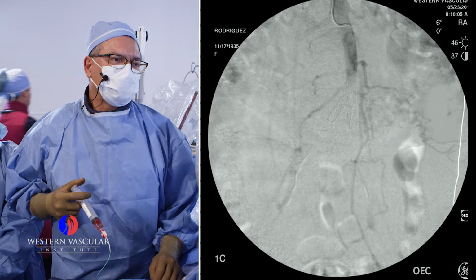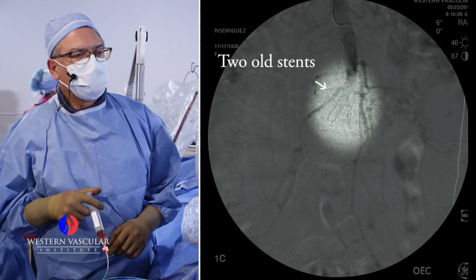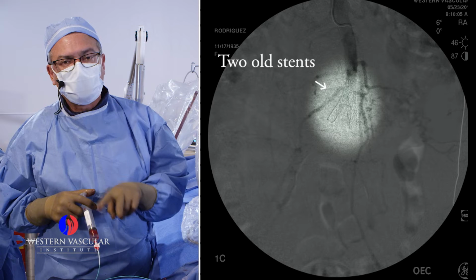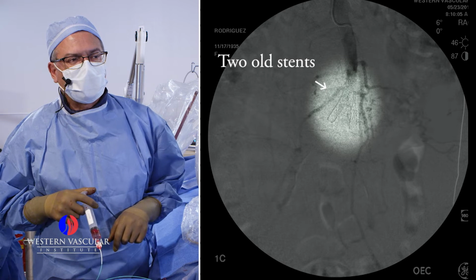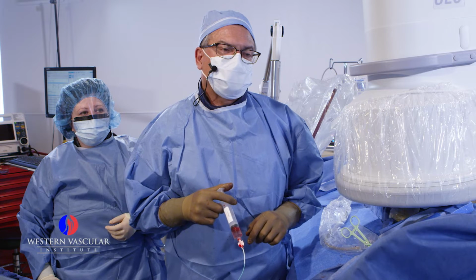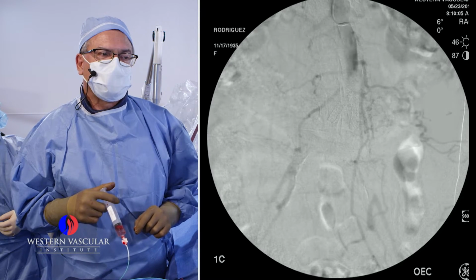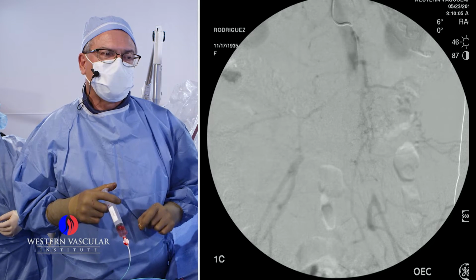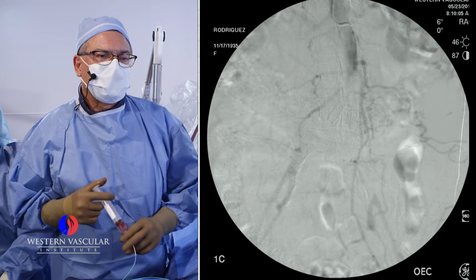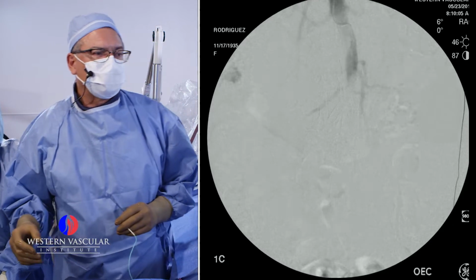And then in the lower portion, I don't know if it's possible to see on the screen, she has two stents placed at what we call the bifurcation of the aorta. That's where the aorta divides into two limbs, or two arteries, and those arteries are the beginning of the flow to the lower legs. One branch goes to the right leg, the other one is supposed to go to the left, but we don't see that. What we see instead is an absence of flow between the end of the aorta and those two branches. And you can see in the background the mesh of the two stents that was placed almost 5 years ago by another institution.